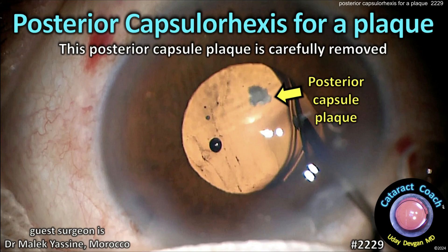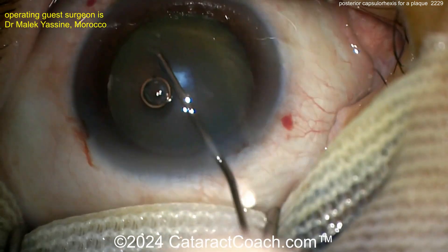CataractCoach.com. Posterior capsule rexis for a plaque. This posterior capsule plaque is carefully removed by doing a posterior rexis.